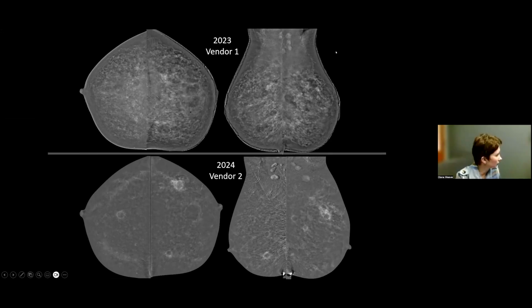But even looking at, let's say, this slightly thicker skin, slightly more of a breast-in-breast artifact, and just an overall little different appearance. So that was the purpose: just keep in mind that they can look a little different. In summary, this was just benign bilateral fibrocystic changes.